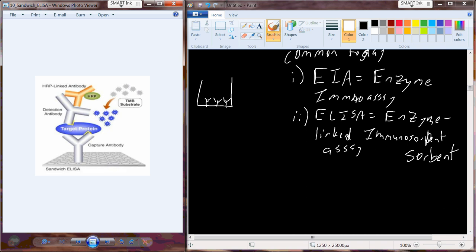This is part of an immune system, right? Antibodies tag whatever foreign object is exposed inside of the system. So in this case, that capture antibody is programmed against some sort of target, and it'll bind that target, basically flag it or tag it, and hold on to it, captures it. And so now you have that target protein captured on that capture antibody as well. Hopefully that's not going to get washed away or removed either.